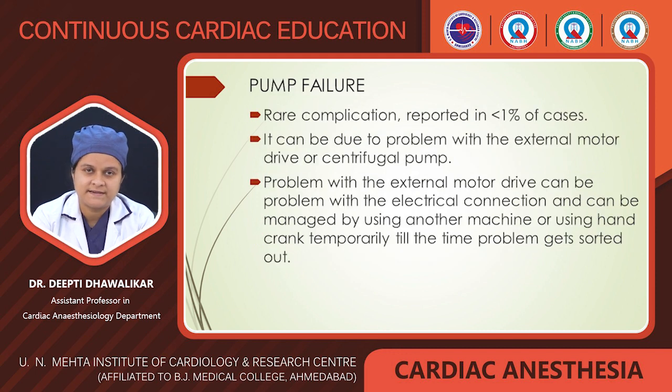Pump failure is again a rare complication. It is reported in less than 1% of cases. It can be due to a problem with either the external motor drive or the centrifugal pump. A problem with the external motor drive can be a problem with the electrical connection and can be managed by using another machine or using the hand crank temporarily till the problem gets sorted out.